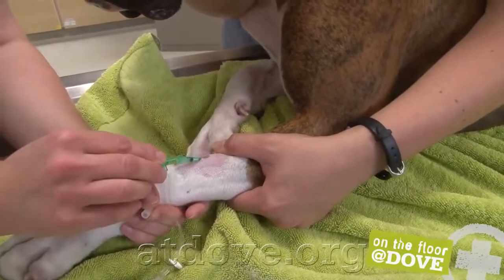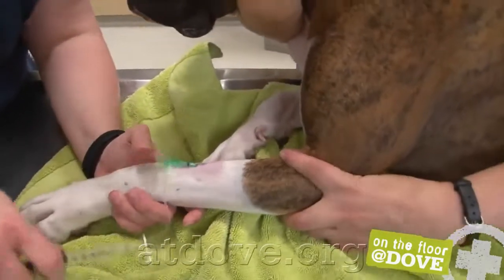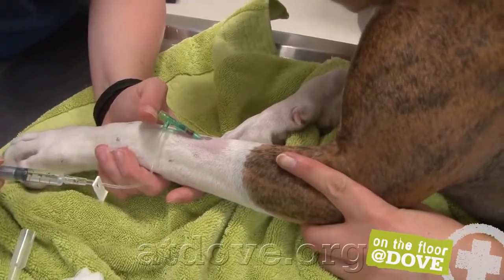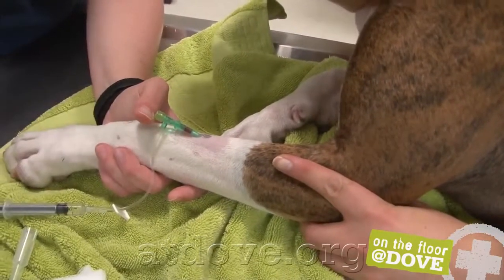Got a T-set here. Make sure I've got a good connection there. Draw back on the T-set. I've got good blood flow, so I know I'm in the vein. Then I'm going to flush. It's flushing easily. I don't see anything blowing up, so this is a good placement.